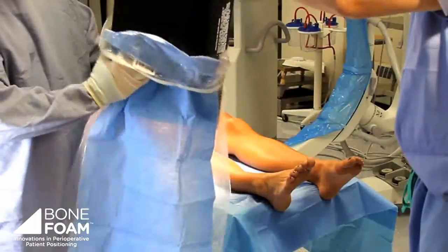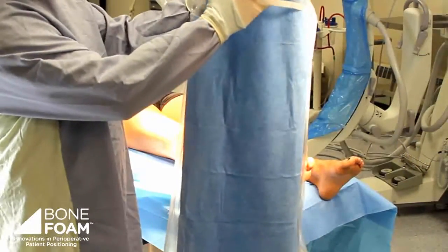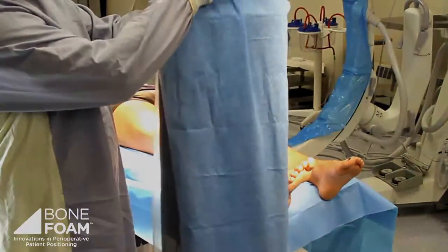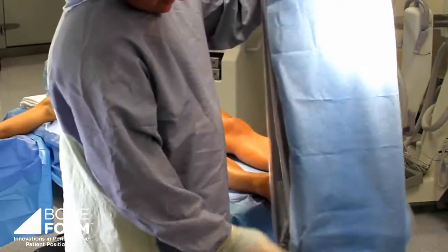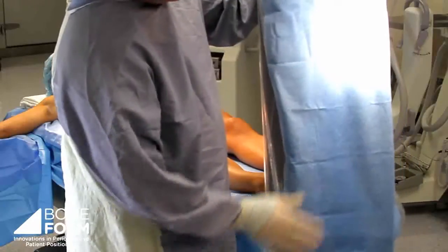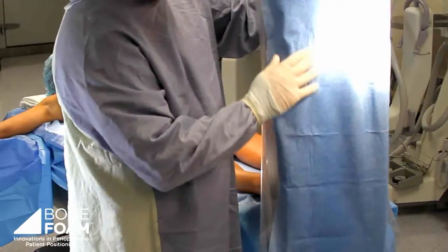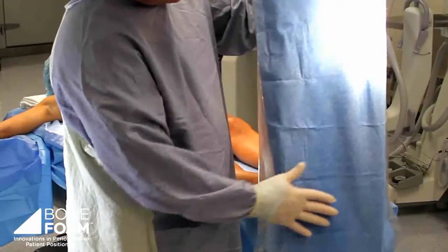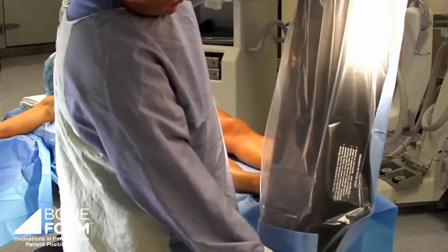Here I'm simply going to demonstrate the placement of the leg elevator in a sterile bag. Some surgeons prefer to have this sterile feature so that the ramp can come onto the operating room table field and off of it. This allows the piece to be more portable during the entire procedure. You can see it has this nice durable feature for the working surface, and the rest of it is durable plastic.